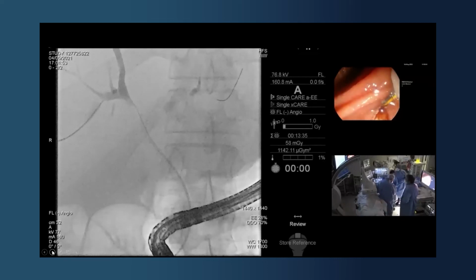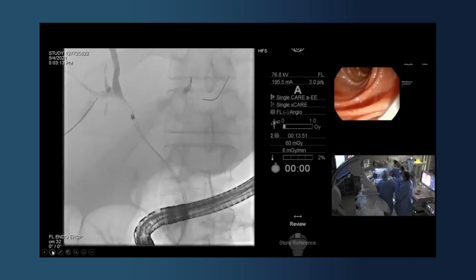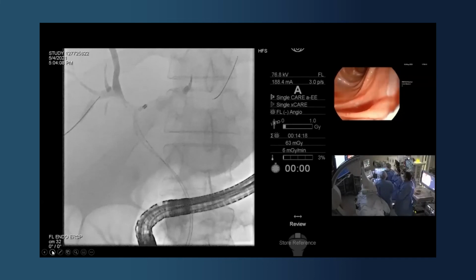So this is interesting. Because of the angulation of getting into left, we can't quite get the stent to go round the corner over the 0.035 wire. Okay, so what we're going to try and do is change this 035 rather standard floppy wire for an 035 super stiff wire. Now, can you get that round the corner? That's the question. Very nearly there.